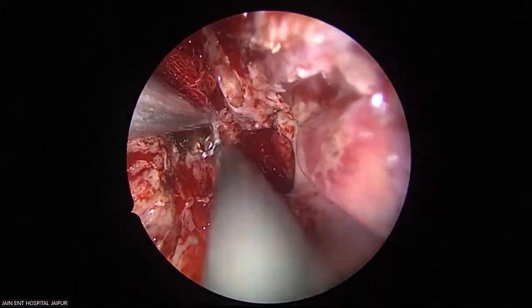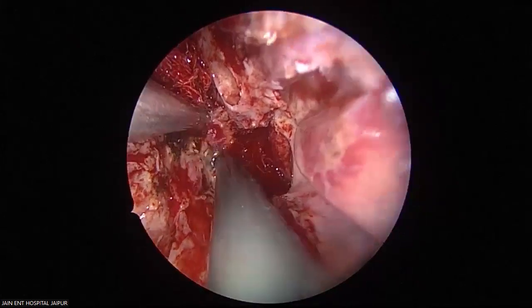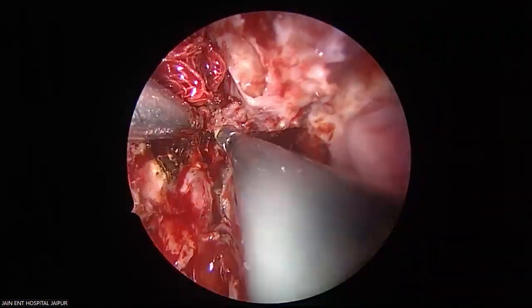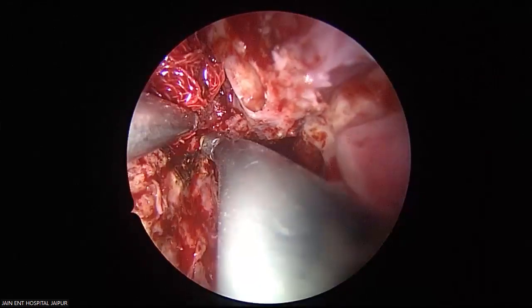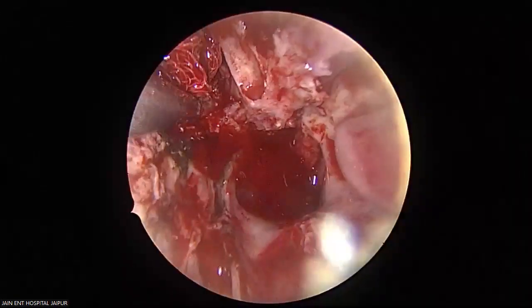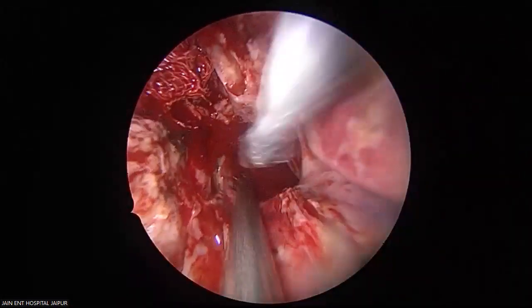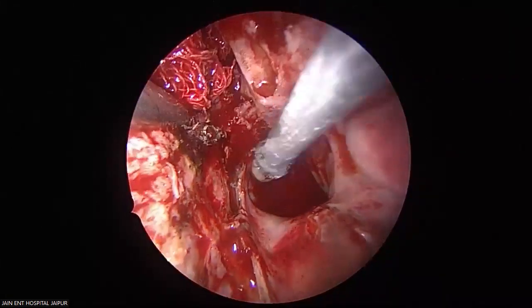Much better now? Okay. Yeah. Color. See, whatever bleeder is coming from the bone, see this? Never use the coblator over it.